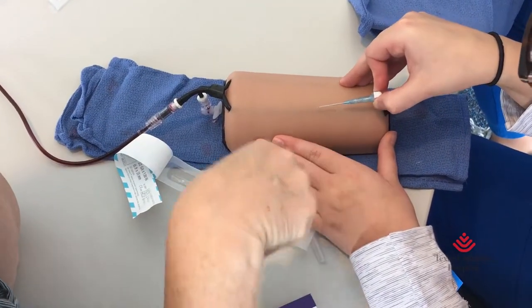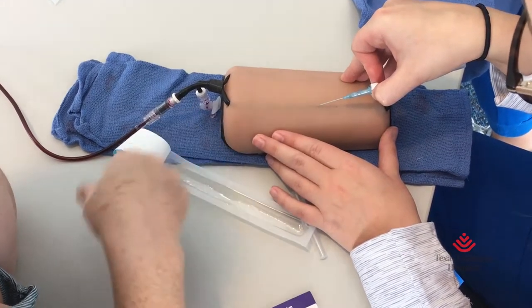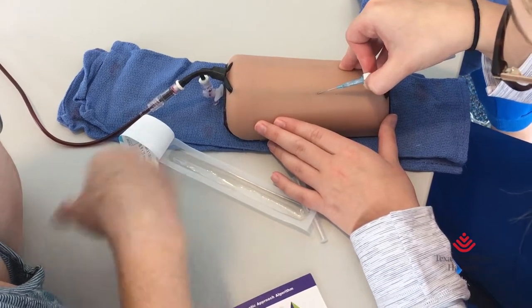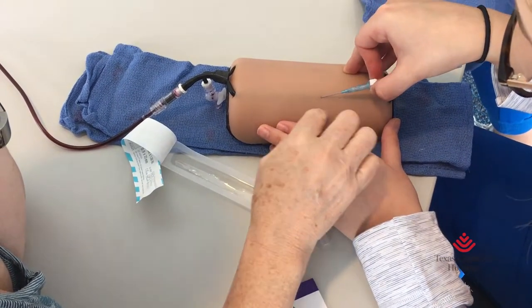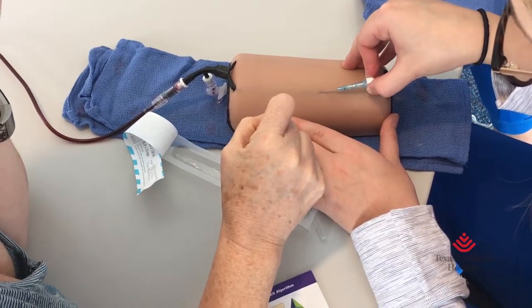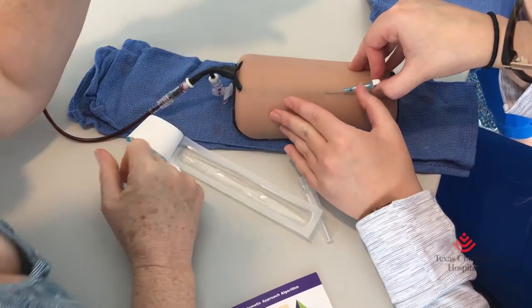Go at an angle. You want to start at a bigger angle — use that point for what it is. Actually get in the patient. Once you get a flash, go in. There you go — now drop. Drop down to almost flat, go in just a hair. You feel that little release? Now slide off the catheter.